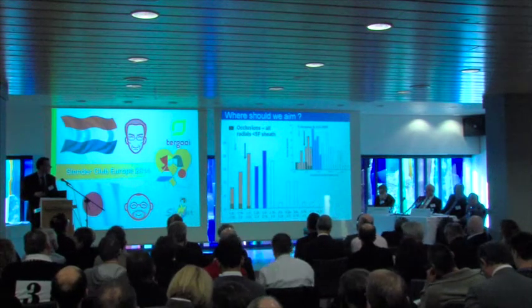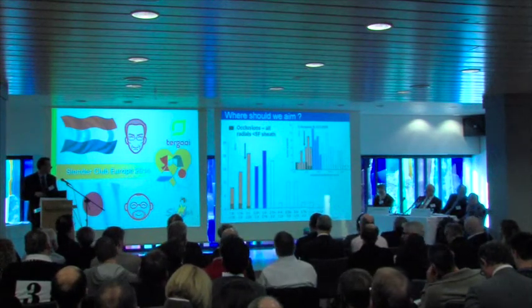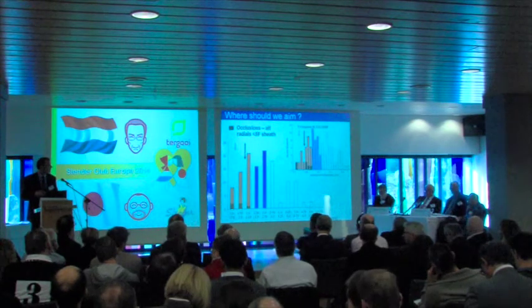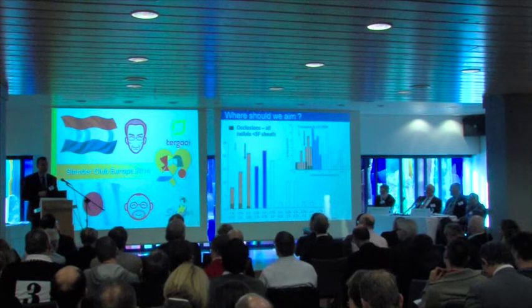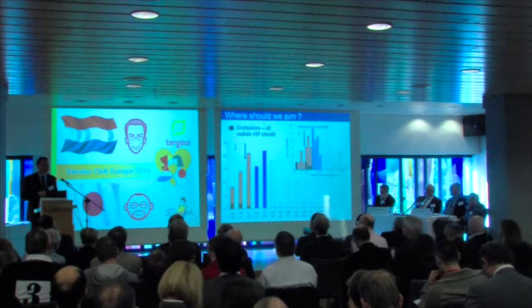And so where should we aim? And this is my personal view. I think that for intervention we really have to try to aim for 2 millimeters or less for our sheath or catheter size.